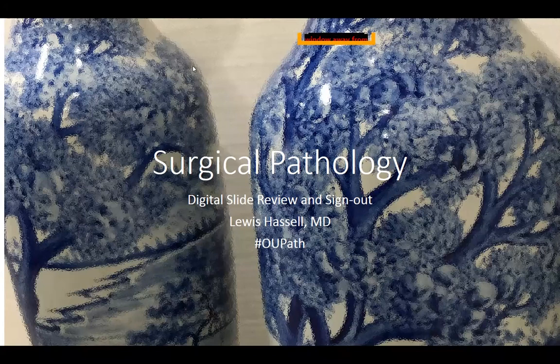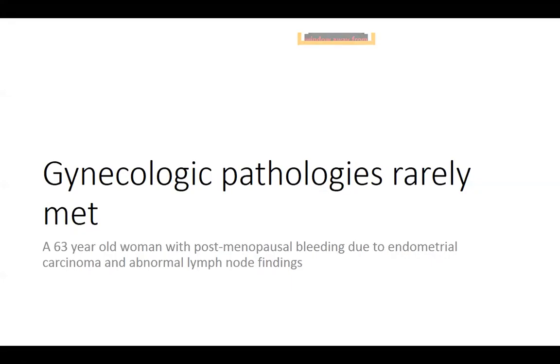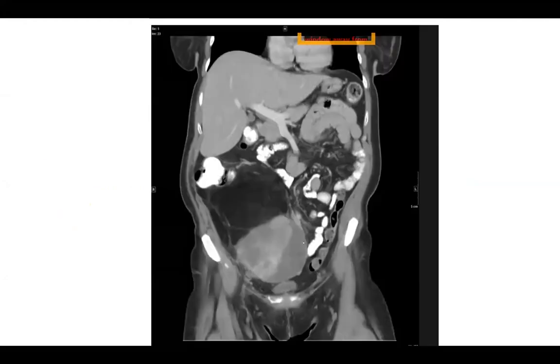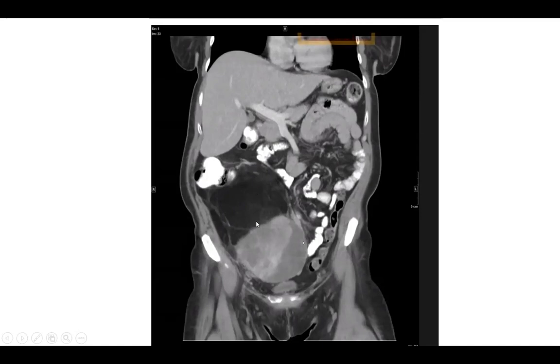Our case today is a remarkable case, not frequently encountered in GYN pathology. The patient is a 63-year-old woman who had postmenopausal bleeding and was thought to have carcinoma, perhaps involving her uterus and ovaries, primarily due to the massive abdominal mass seen on CT. As we can see from this CT scan, the mass is quite heterogeneous — it has some hypodense areas, some hyperdense areas, variable density, and is certainly displacing many intra-abdominal and pelvic organs.